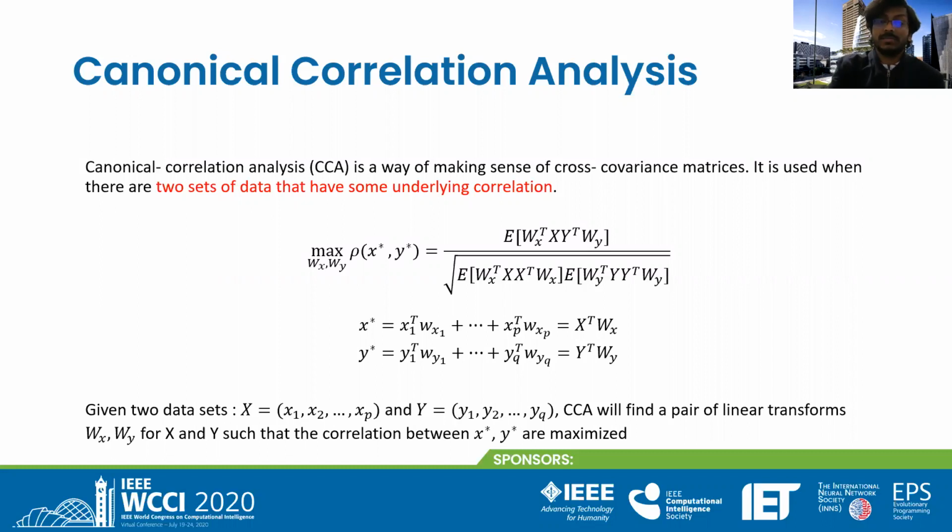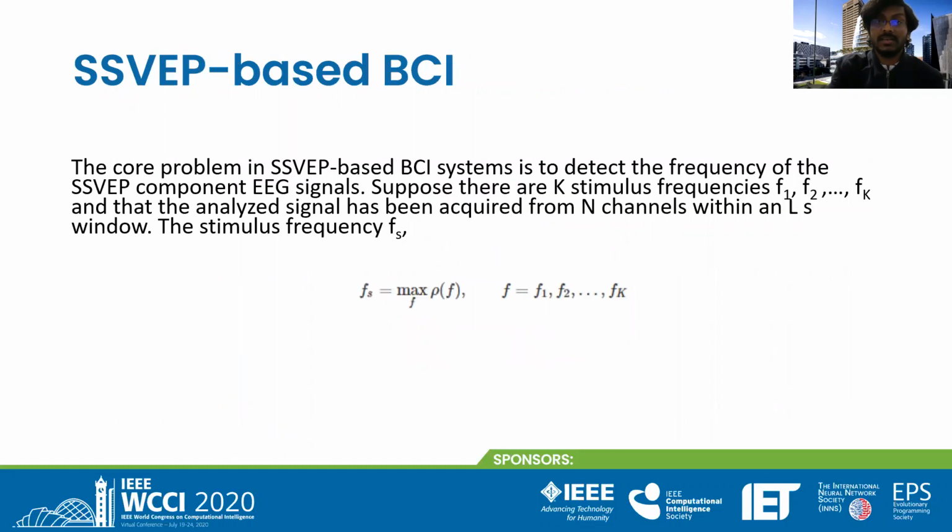One important thing I forgot to mention here is that because you have the context of SSVEP based BCI, you know which frequencies you are presenting to the user. Those frequencies are always known, they're not unknown frequencies. What you need to find is which frequency the user is looking at from the set of frequencies you provided him to watch.